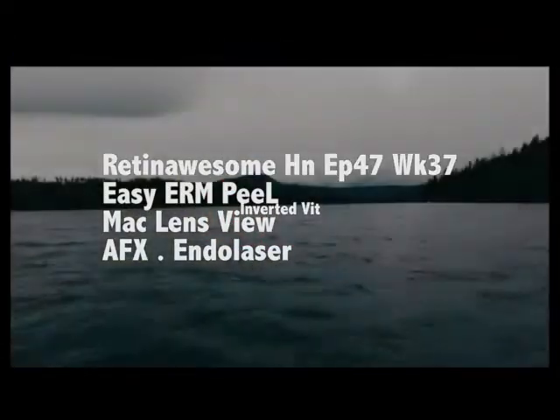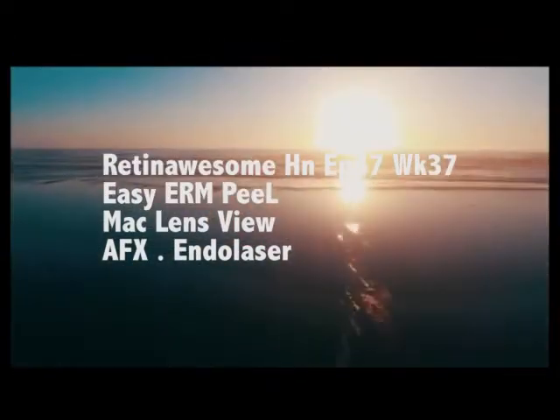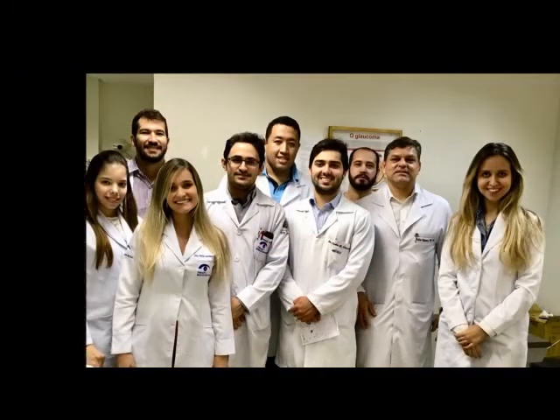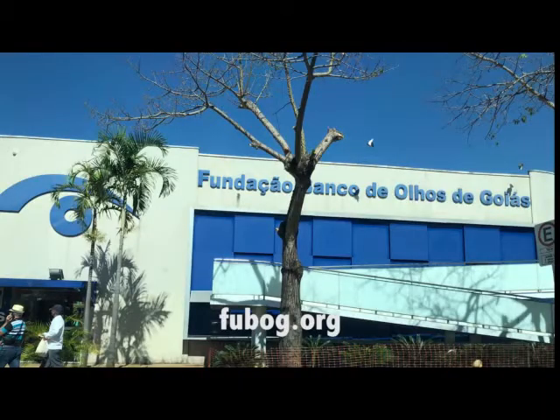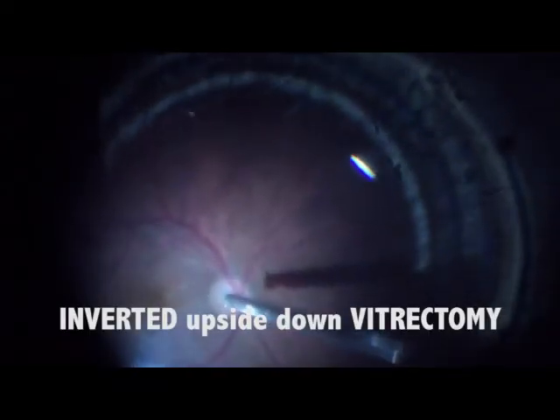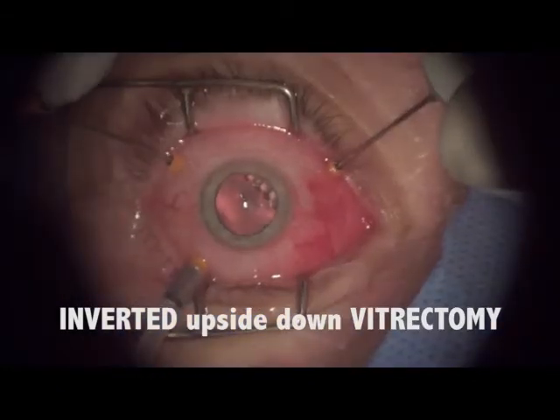This is Retinal Sump Episode 47: Easy Epiretinal Membrane Peel. That's Inverted Vitrectomy at the iBank Foundation in Goiânia, Brazil. We did our fellowship in Toronto, Canada. This is Inverted Vitrectomy.